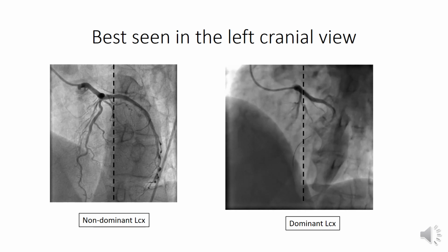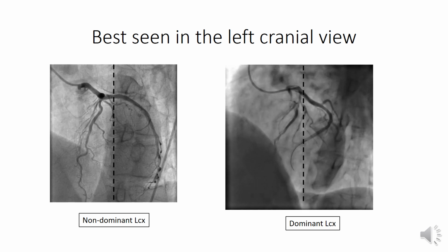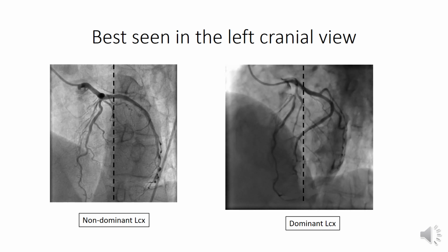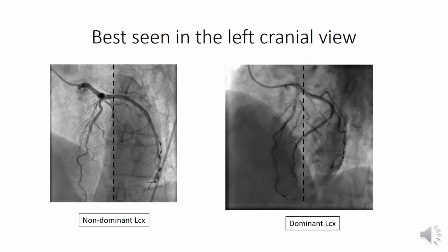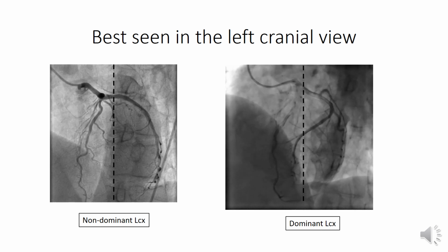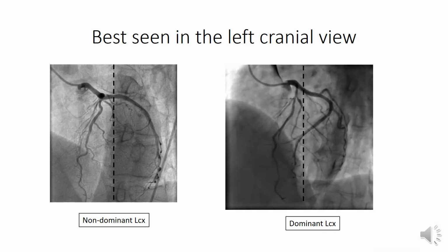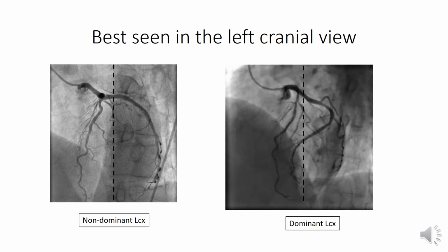In this example, this is the left main, and here is the LAD running along the picture in the interventricular septum, and here is the circumflex artery. We look if we see a branch that crosses the midline and runs on the posterior surface of the septum, or in other words, the posterior descending artery. This means that the left circumflex is dominant, which is the situation in this patient.